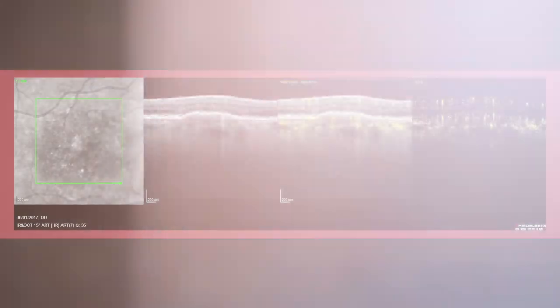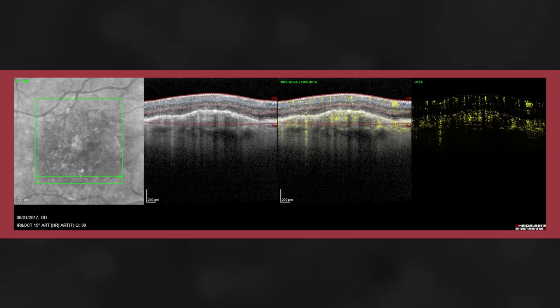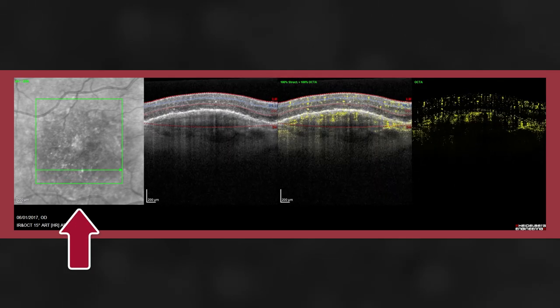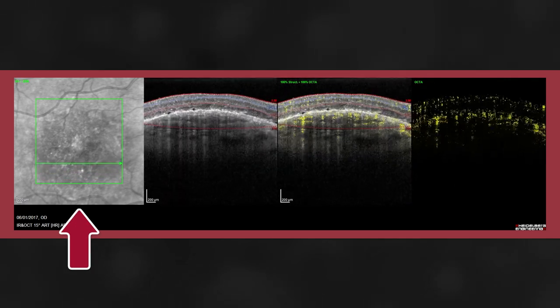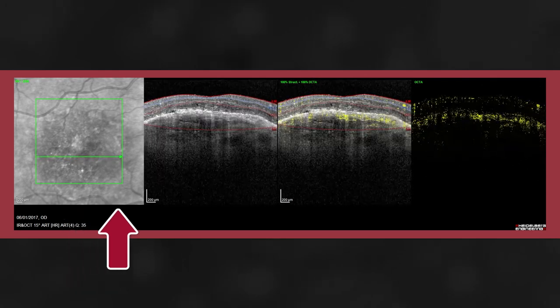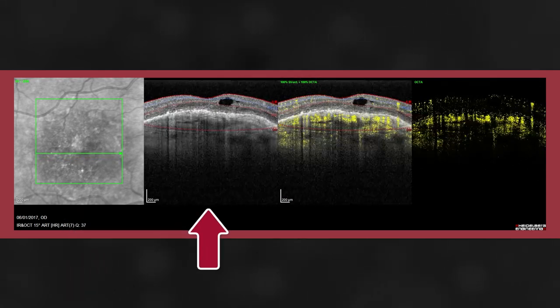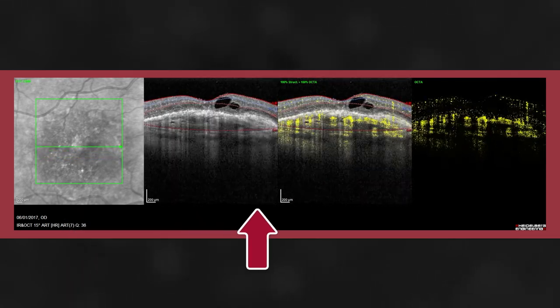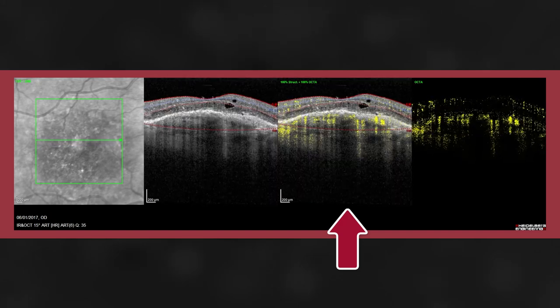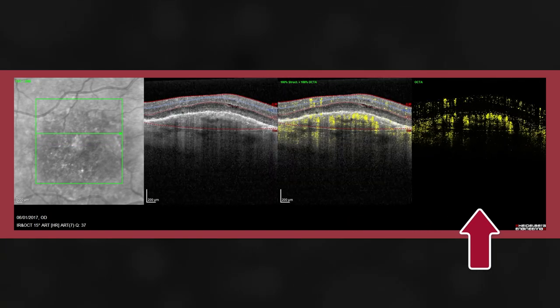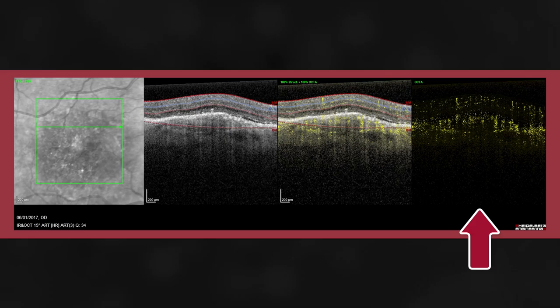In this exported video presentation, we can see the fundus reflectance image with the moving B-scan position, the structural B-scan, the structure with the overlaid flow, and the isolated flow information within three separate panes.